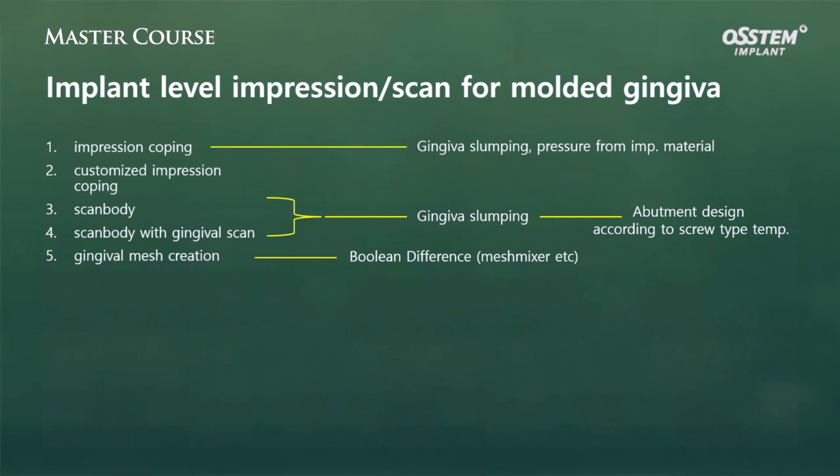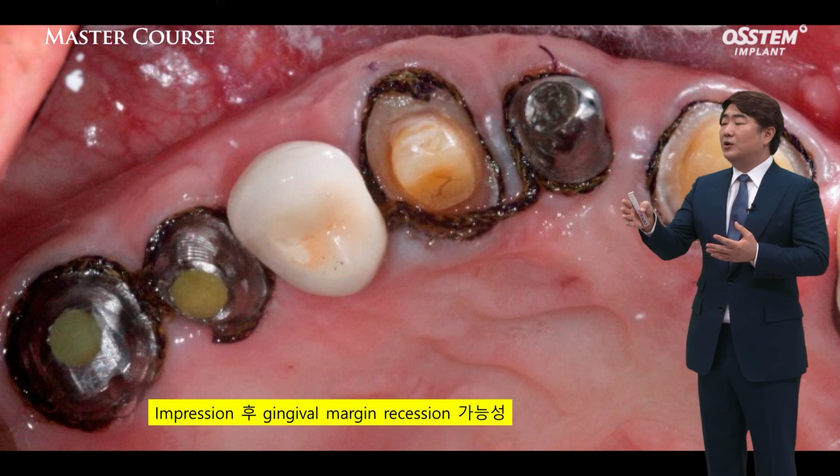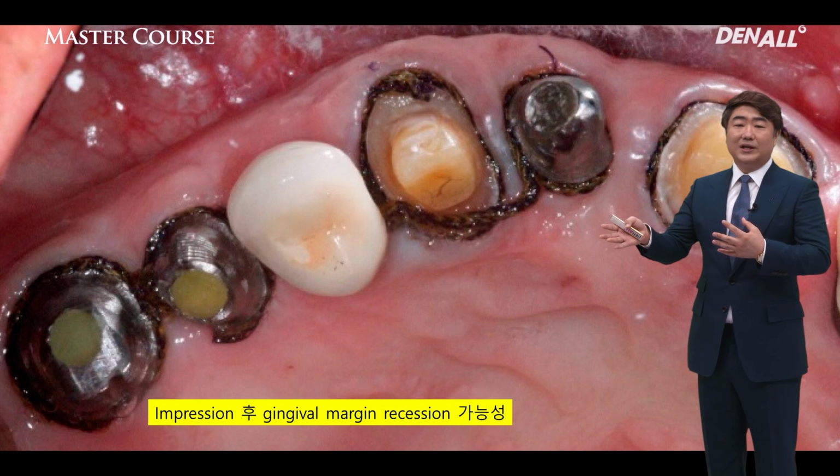Now, the implant level impression or scan used for the final abutment is what I talked about. But besides that, for the final crown to be delivered, if you take the abutment in and out, that could impact the gingiva margin. So abutment level scans or taking an impression there would be best. For the margin area to have good finishing, if you put in a cord, then again it can impact the gingiva shape.